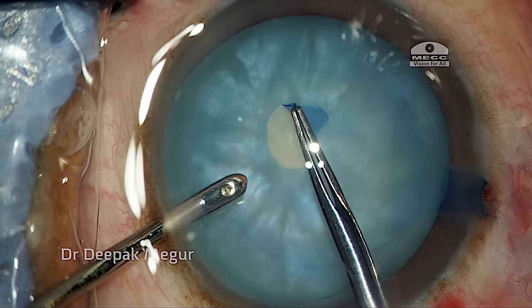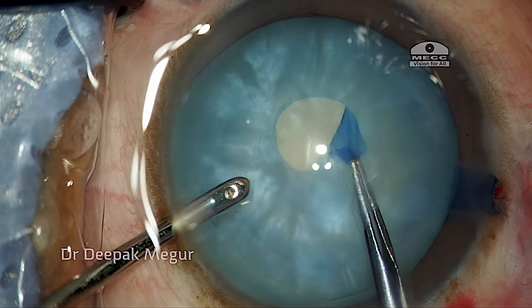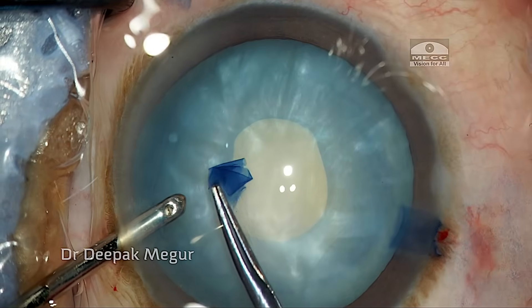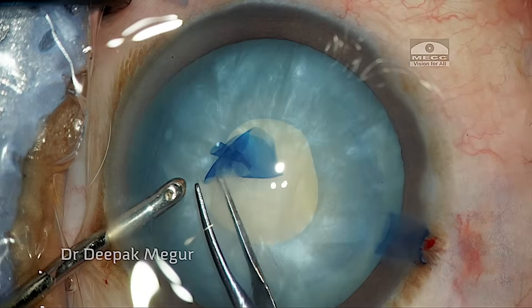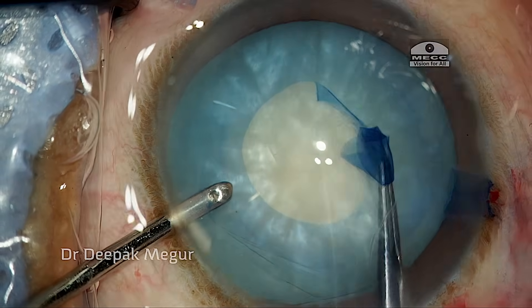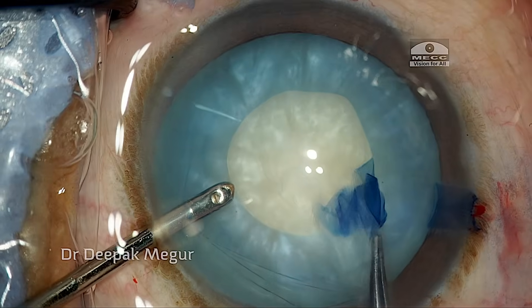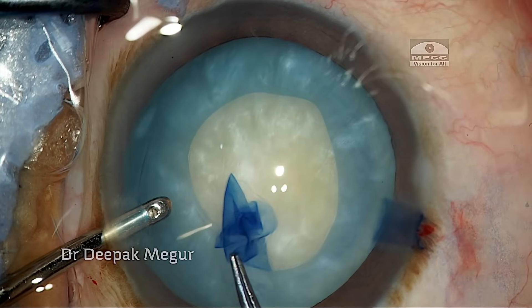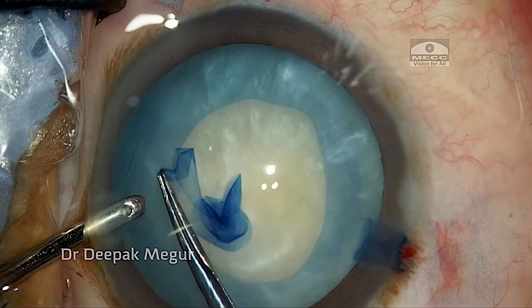After making the initial puncture, I'm using the Haldipurkar forceps to make an initial small rhexis of around 3 mm. As soon as I near completion, the thin flap of anterior capsule is slightly pulled away, and then the flap is continued in a way so that we enlarge the size of the rhexis.